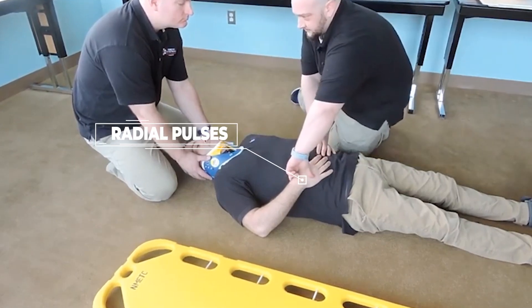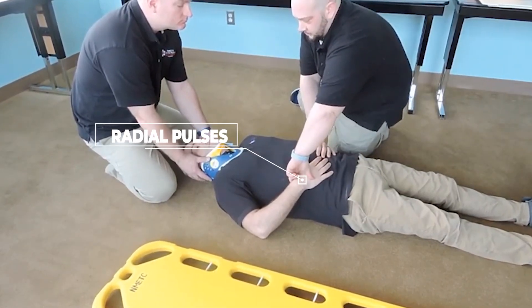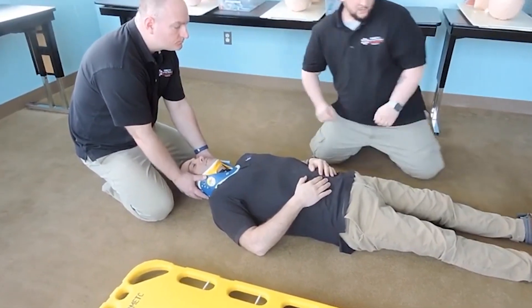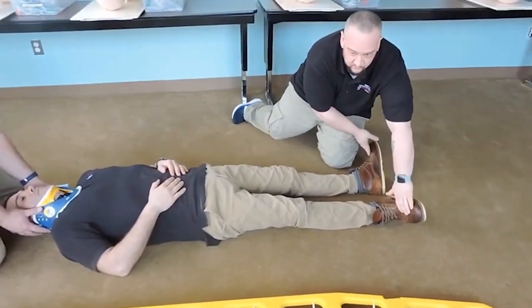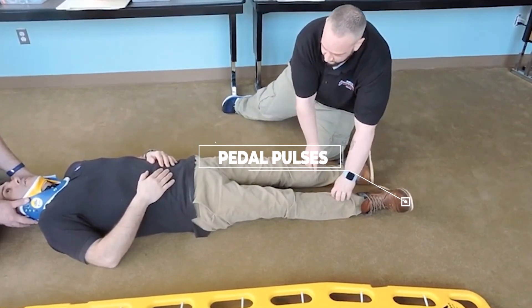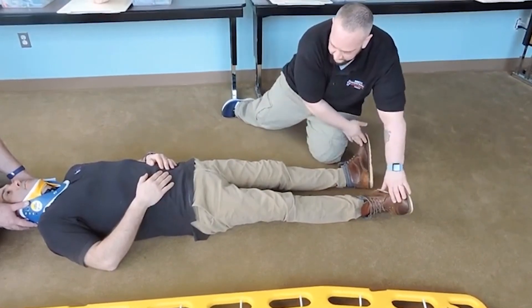I'm going to reassess pulses — good strong pulses, even on both sides. Can you feel me touching you, sir? Yes, still the same? Yes. Can you squeeze my hands? Checking the pedal pulses again, shoes removed. Good strong pedal pulses. Can you feel me touching you? Yes, same on both sides? Yes. And can you wiggle your toes for me again?